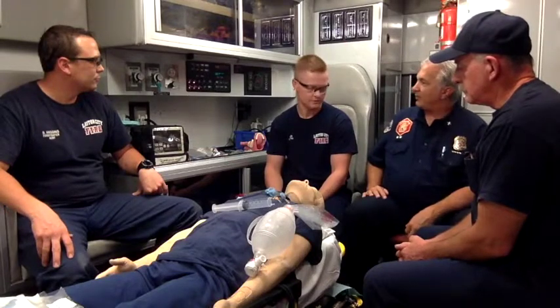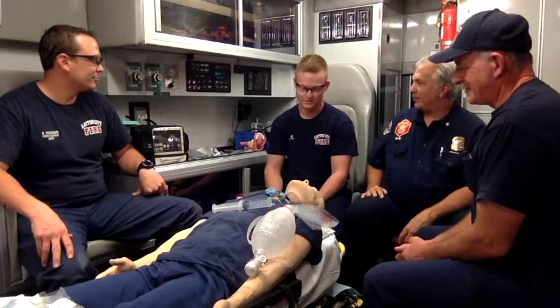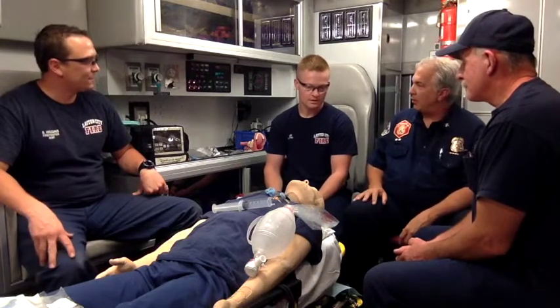Why no gag reflex? Because it's a contraindication. Right, good. And you're going to get a vomit geyser, right? Okay. So is there a time when you wouldn't? Do you know, and you mentioned contraindications just now. Do you know what they are?